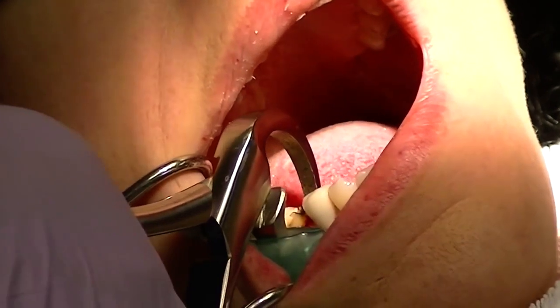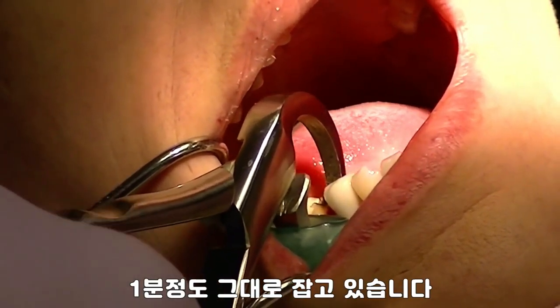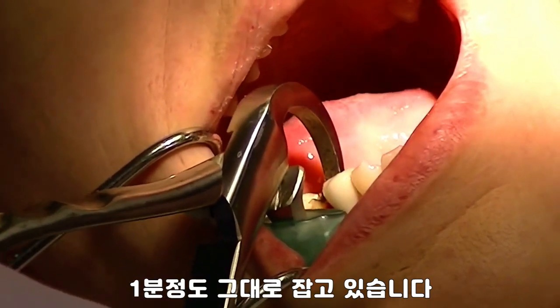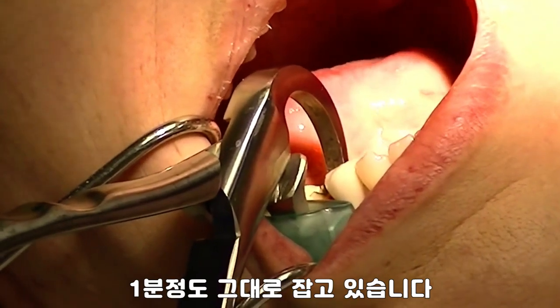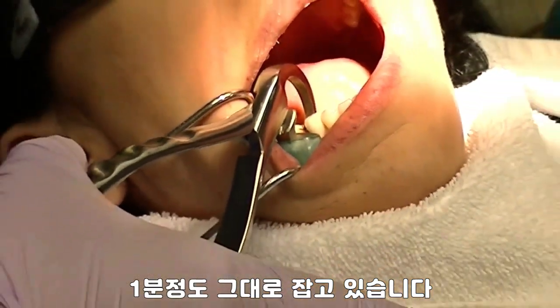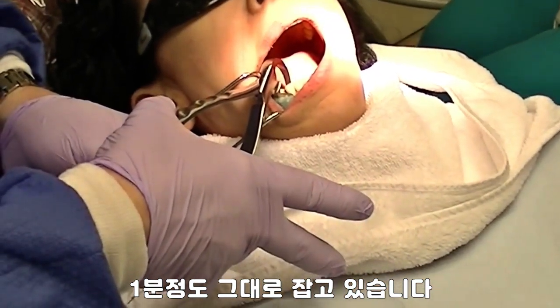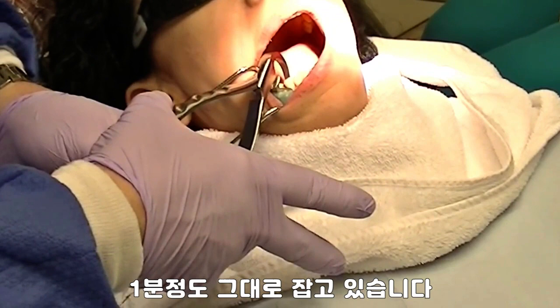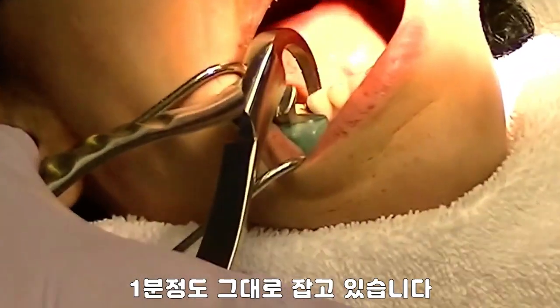When you break down the periodontal ligament, the tooth will come up and out of the socket. Take the beak and engage the lingual surface of the root, and place the bumper as far down the vestibule as possible. I'm not squeezing the handles — I'm holding them and creating tension onto the lingual aspect of that tooth. The bumper is simply a fulcrum.